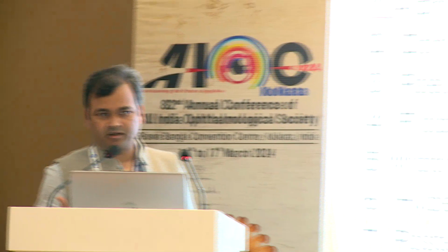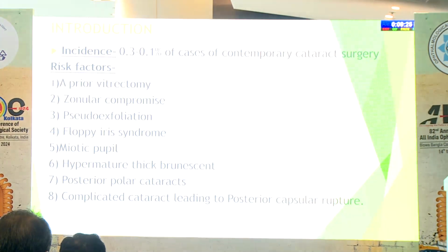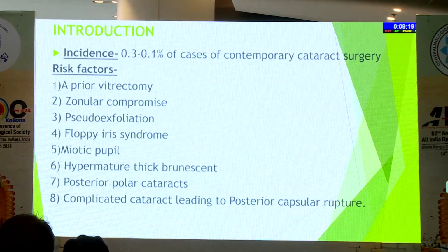No matter how much experience you have, sometimes it does not matter. Even these are a few risk factors in such cases. Even if you have done thousands of surgeries or lakhs of surgeries, sometimes you face these challenges: how to handle these cases and prevent the nucleus drop.